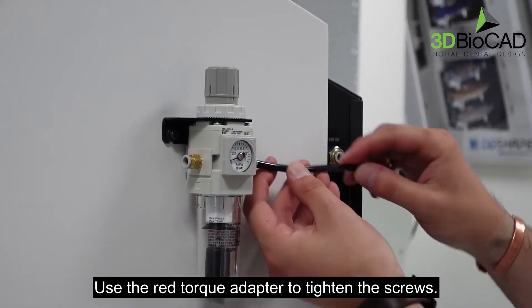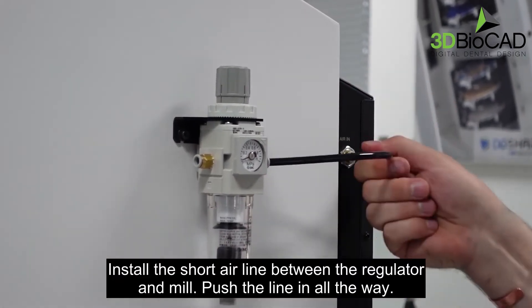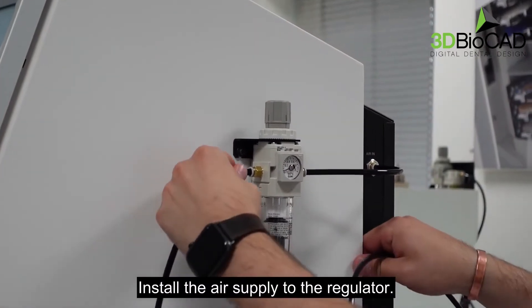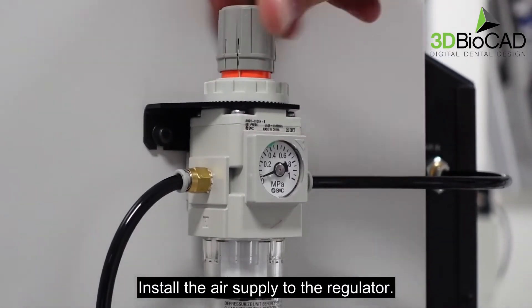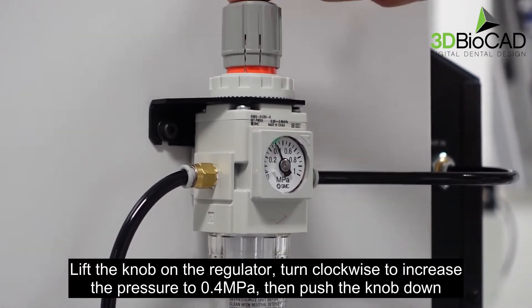Install the short air line between the regulator and the mill — push the line in all the way. Install the air supply to the regulator. Lift the knob on the regulator, turn clockwise to increase the pressure to 0.4 MPa, then push the knob down.